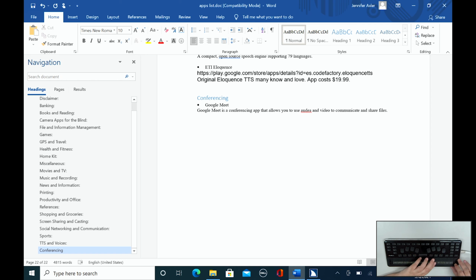So when you're operating, as I mentioned earlier, it's probably easier to use computer braille so that you are able to actually use computer keystrokes, use first letter navigation, etc. However, when you're typing something longer, you may choose to use contracted braille that may be more intuitive for you. And of course, I need to fix this audio.